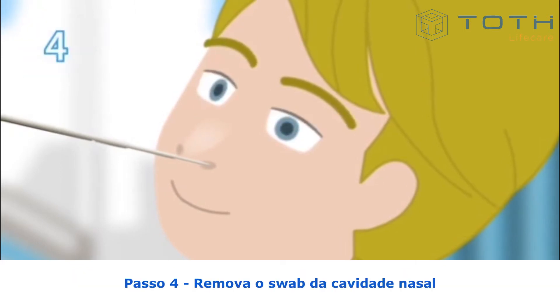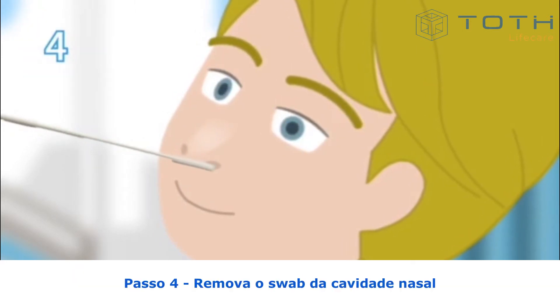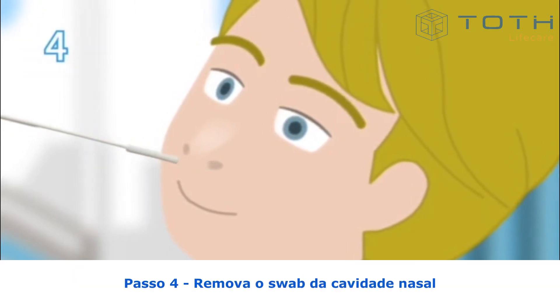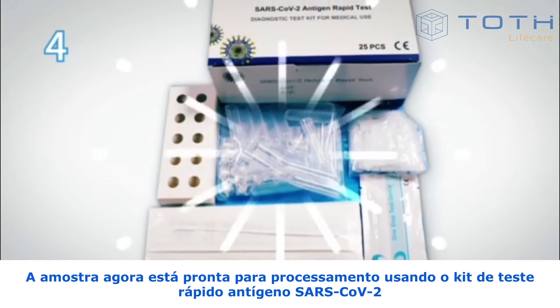Step 4: Remove the swab from the nasal cavity. The specimen is now ready for processing.